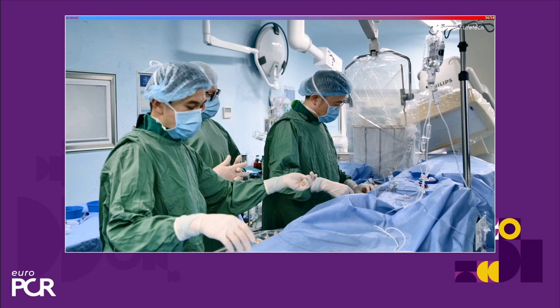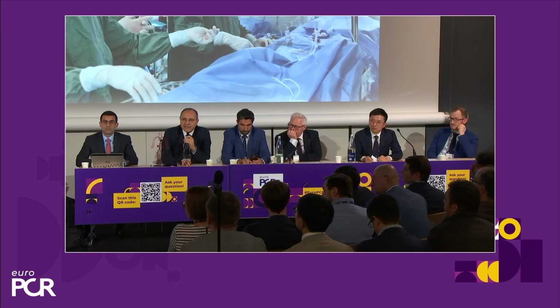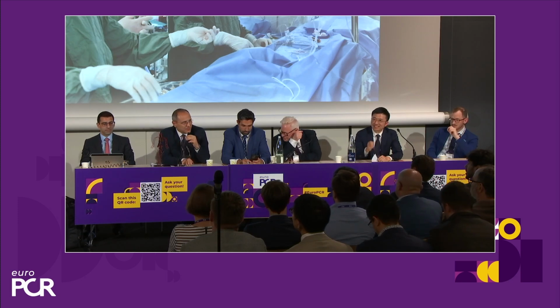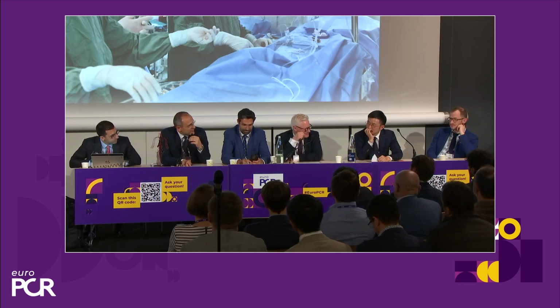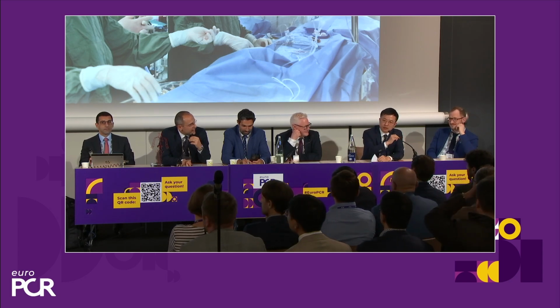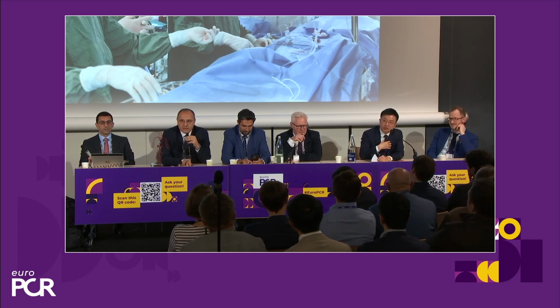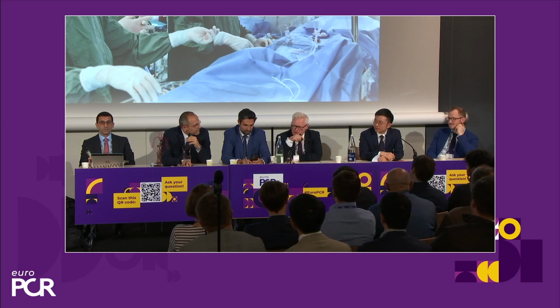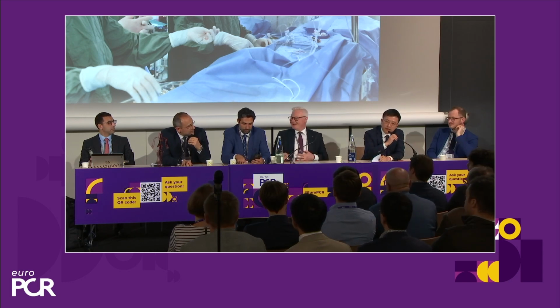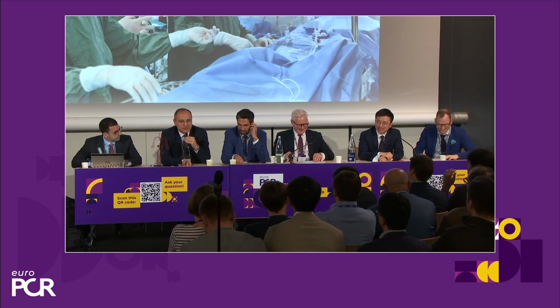What is your point about the ECG? Sorry, I didn't hear. To see on the monitor the ECG on the top. We see the pressure, we see the gradient, but we don't see the ECG. Well, yeah, it's too late. It was recorded two weeks ago. We should have asked for it. What was the ECG two weeks ago, Dr. Chang? Was there any problem there? During adenosine infusion, was there any AV block or something? No AV block, just discomfort. I believe that it was caused by the adenosine infusion, which is very common. Correct. It should be included on the top. Yep. Take note next time. Yeah, that's an important piece of information.